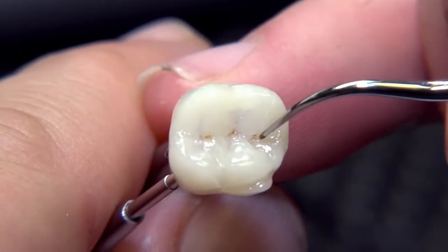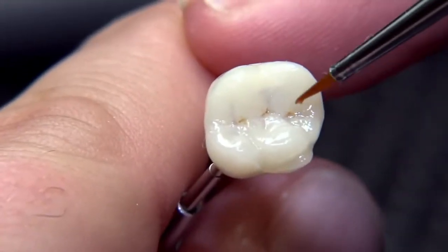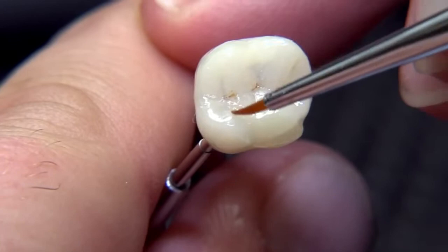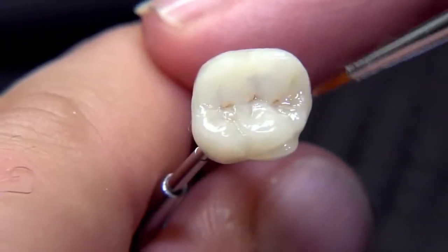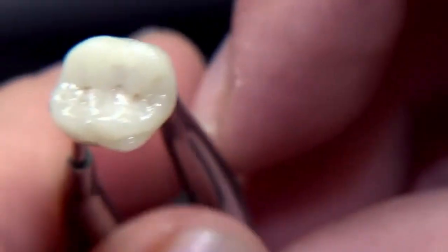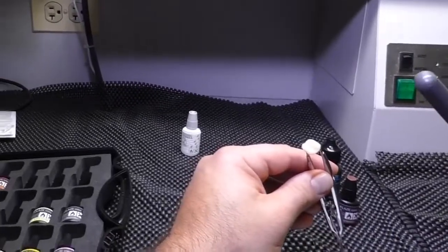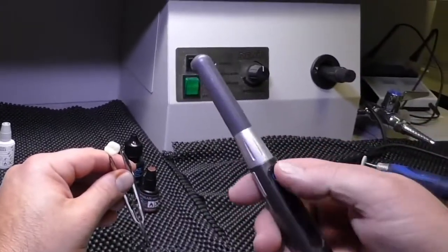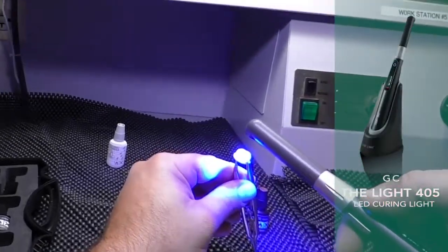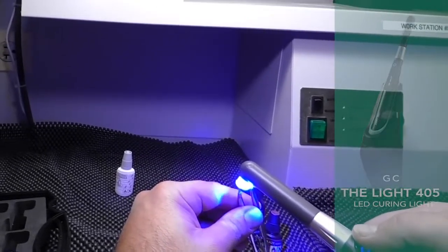We don't want to put a whole lot of stain in this one — something very simple and light is enough to add that depth and give some characterization. Feather out any kind of puddling. At this point, this may be enough for some. We take the light from GC America and light cure that into place — it should only be a few seconds since all we're doing is tack curing at this point.